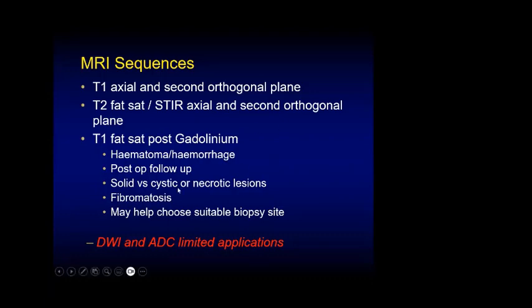Also, gadolinium is helpful to distinguish between solid and cystic or necrotic lesions. We normally give gadolinium for patients with fibromatosis. And also, sometimes gadolinium may be helpful to assess the biopsy site of the tumor.